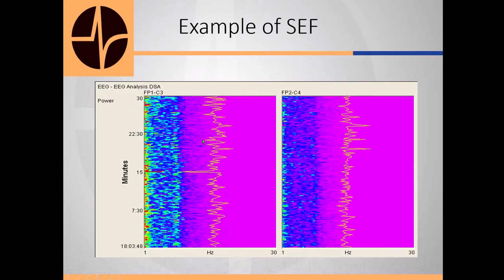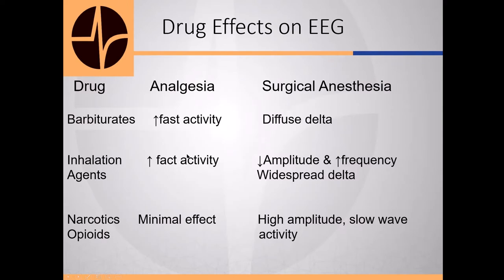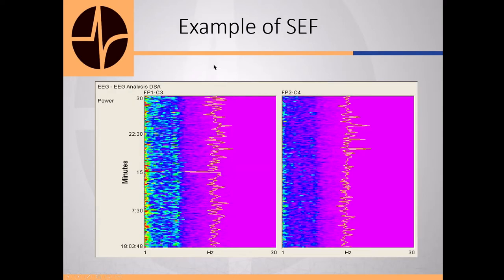So exact same thing. And here you can see, this is pretty straight, but you've got this outlier here. Well, with the DSA, it lines right up there. So if we had the running EEG, the traditional display, there's probably an artifact right there. And you get artifacts out here, and that's normal. But you can see it's pretty much a straight line. It's going up and down. It's not starting here and declining down to here. And in some software, you can actually have the number here, the SEF.